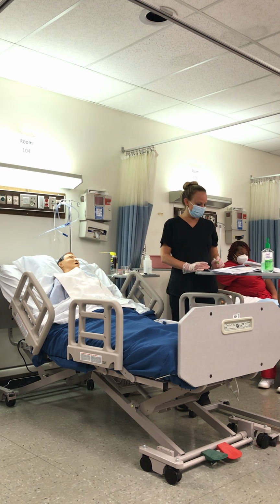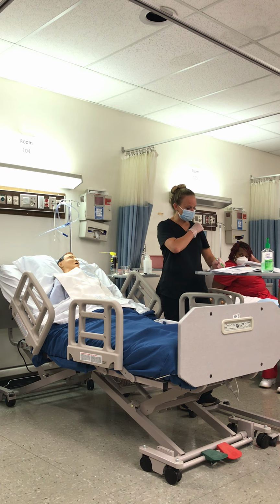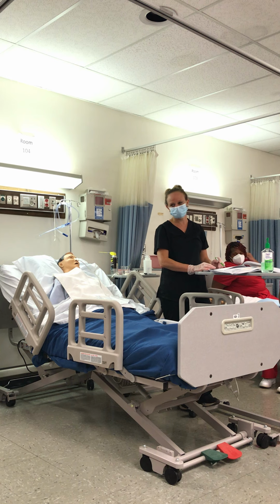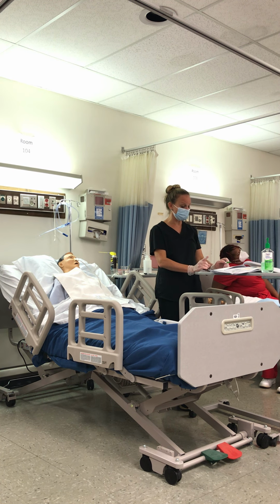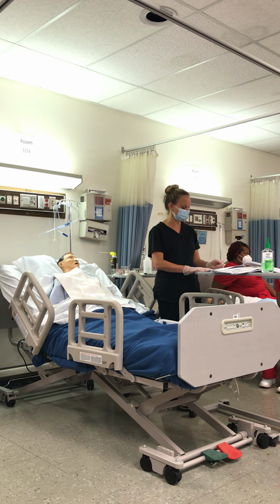We talked about this. Discontinue the procedure. Raise the tube to the first mark if there's signs of distress, such as gasping, coughing, bluish skin color. How quick is he going to turn blue, that quick? No. Or inability to speak or hum. So when you retract that tube back, once they kind of calm down, say, okay, I need you to talk to me. I need you to say something. Or hum, whatever you can do. You want to hear those vocal cords working, okay? So that's something to do before you start pushing that tube back through, okay?